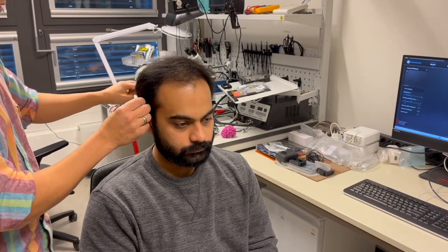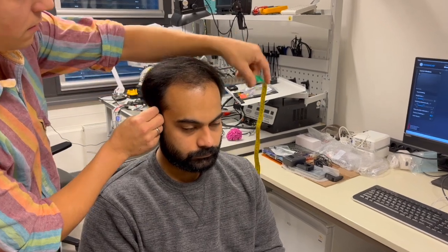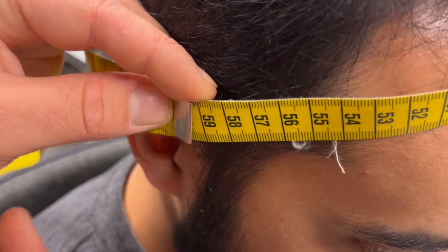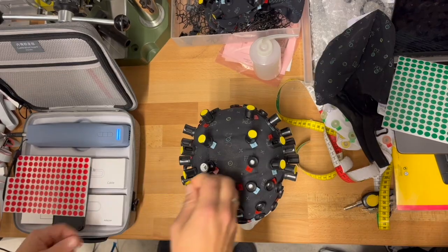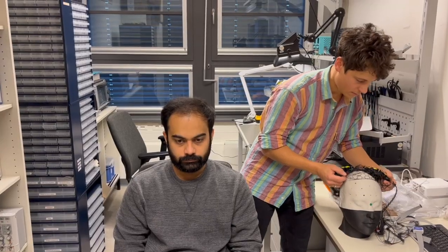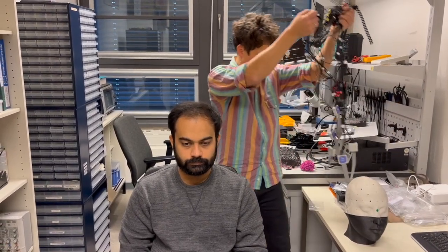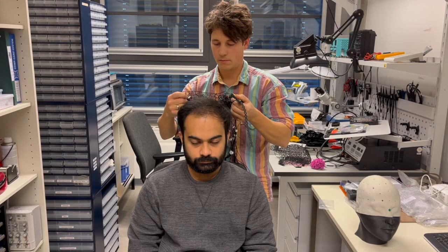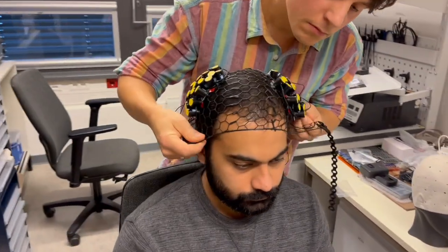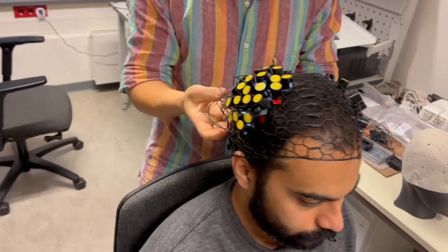First, we are preparing the subject. I'm measuring here the head circumference along LPA, Nasion, RPA, Inion and again LPA, and choose the correct cap size by adjusting downwards. Prepare the cap if not done before and place yellow stickers on each optode. You're of course free to choose any other color, but it's recommended to use a color which is not in the color map of the final 3D image, so it's easier for Cedalion's detection algorithm to automatically detect the optodes later on correctly.